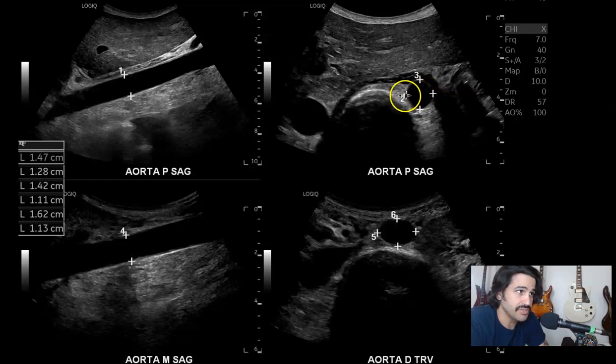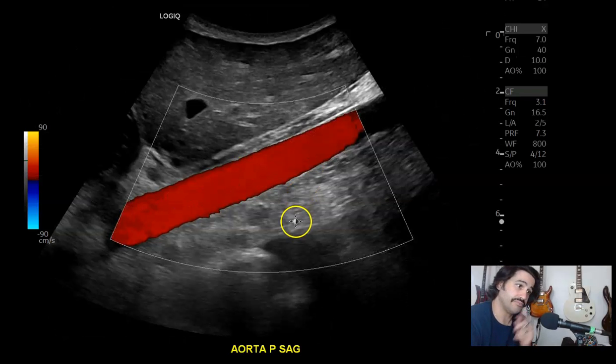When it comes to the lateral — the width — this is a good size to measure it. Some people have been talking about getting the aorta in coronal and measuring it that way, but this is much easier. You can do all your measurements in transverse, AP and side to side. So sagittal, then with color — proximal with color.